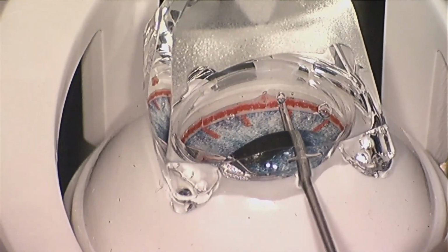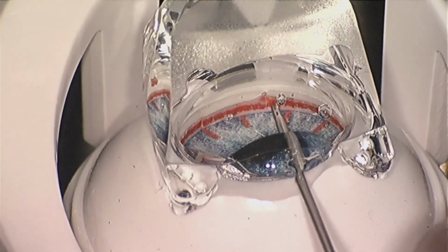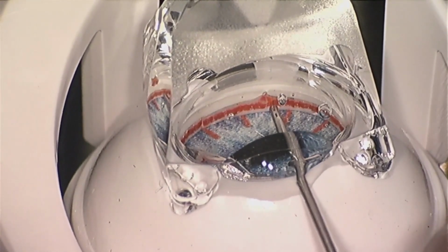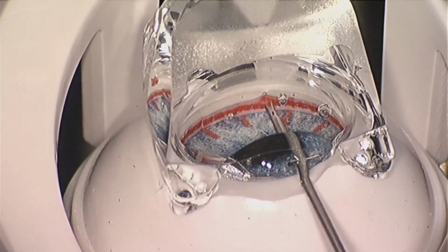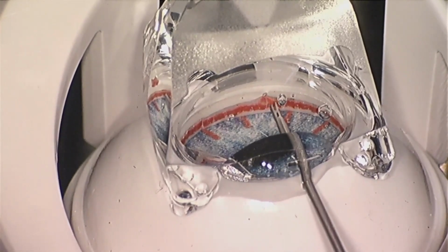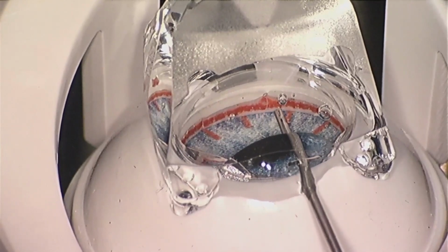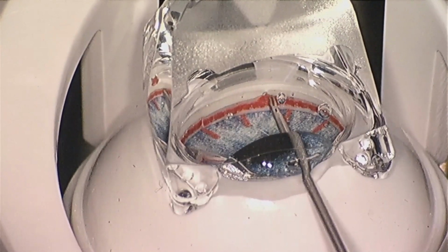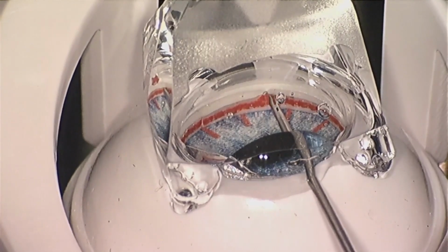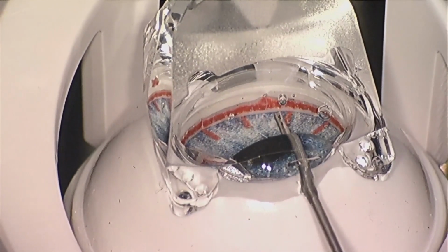So as I mentioned previously, I like to start off on the right-hand side, trying to avoid that bubble there for you. But again, now I've made contact with the trabecular meshwork, and I'm just showing you how much you can wiggle that trocar, and you can see the trocar bias there. So you want to have a nice neutral trocar so that those stents can slide down the trocar shaft uninterrupted. You want to just gently dimple into the trabecular meshwork, and here you can see I'm gently dimpling in, getting ready to push the button, and I fire and nothing happens.